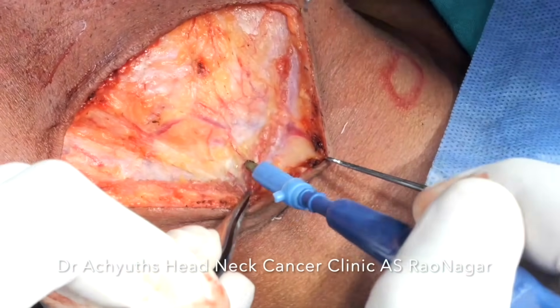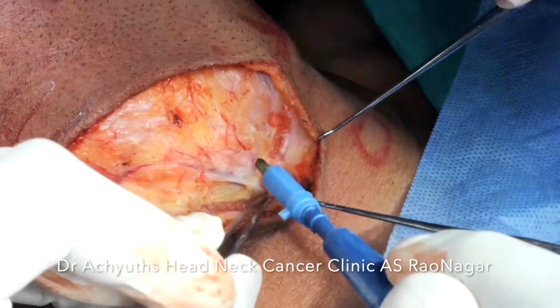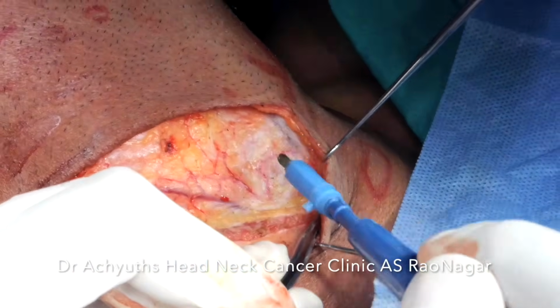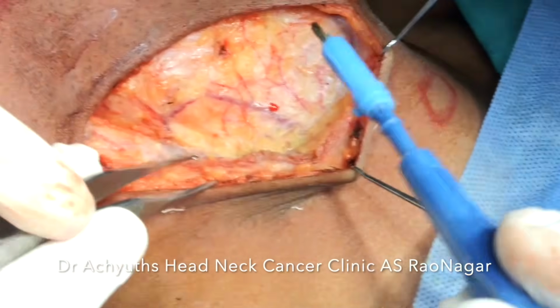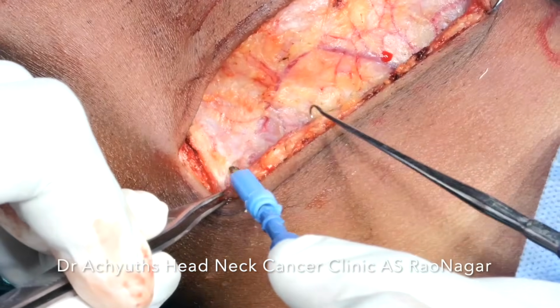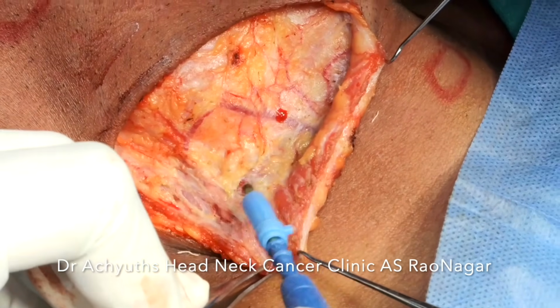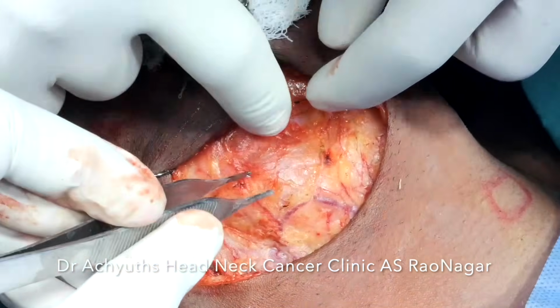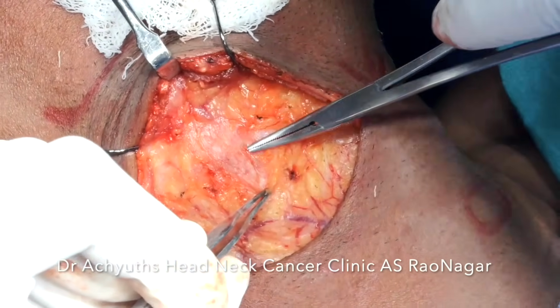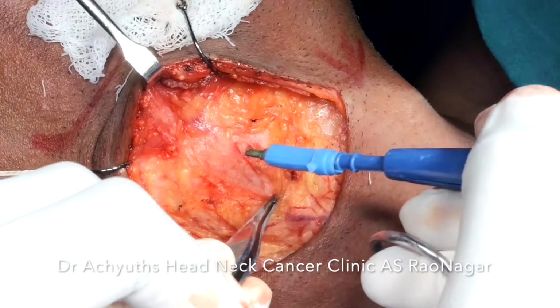This subplatysmal flap raising was initially difficult for me even in my residency period, because most of the times what happens is we use cutting current, and when we do not have control over the cautery, we do it more with a shoulder movement or elbow movement rather than using our wrist. We tend to overshoot and go through the platysma into the skin. So buttonholing and all were done during the residency period, unfortunately. But with time we usually understand how cautery works and we do better.